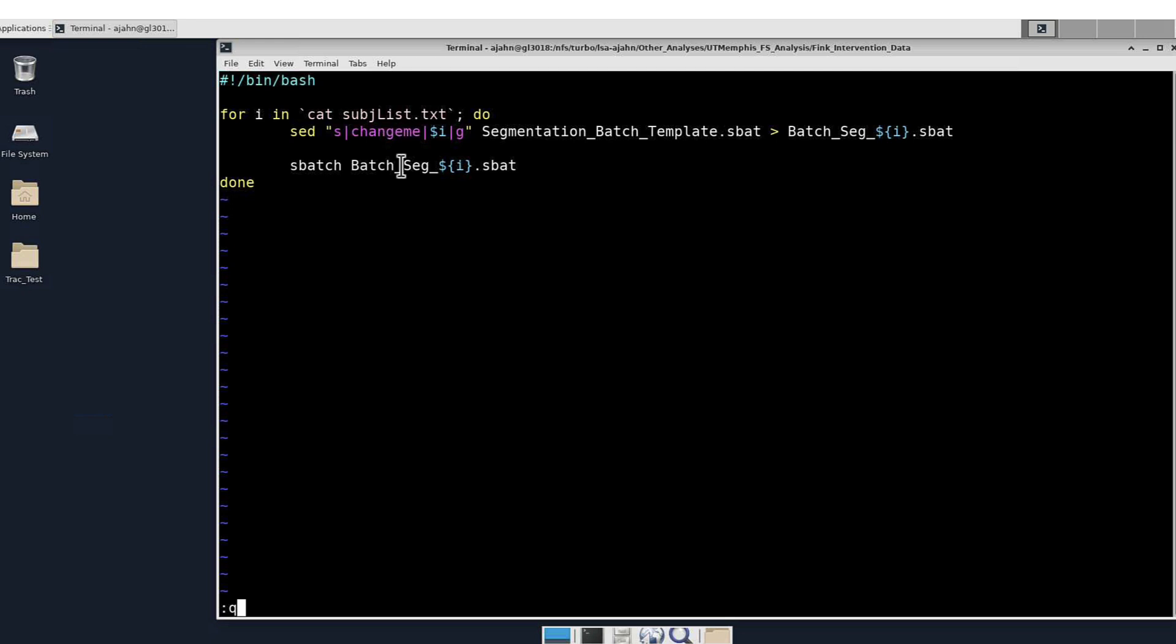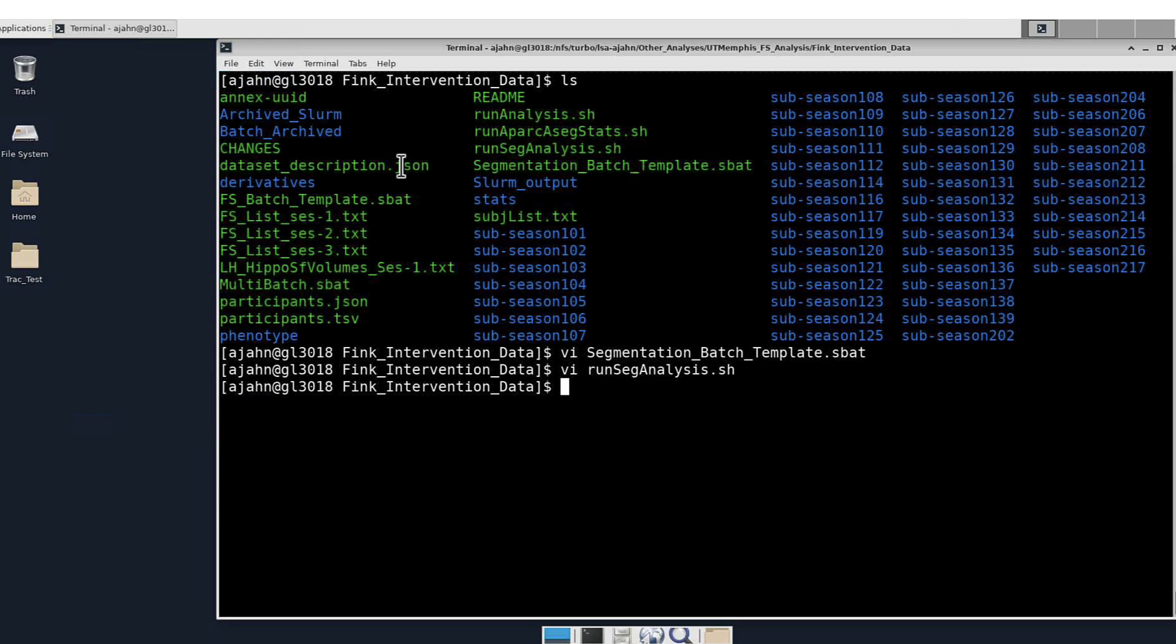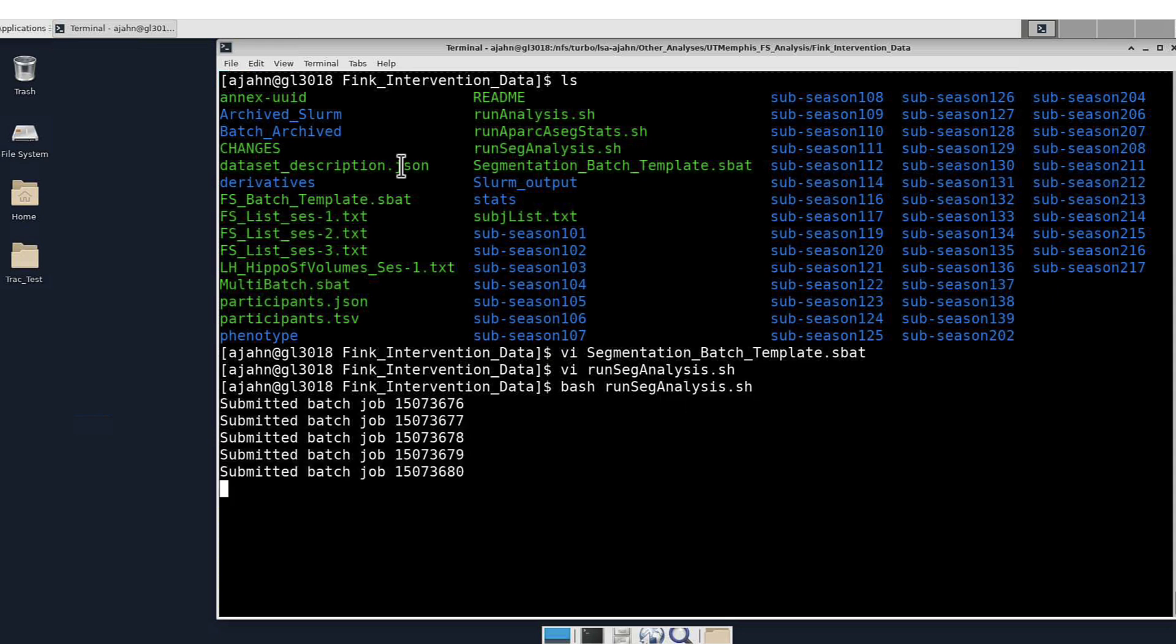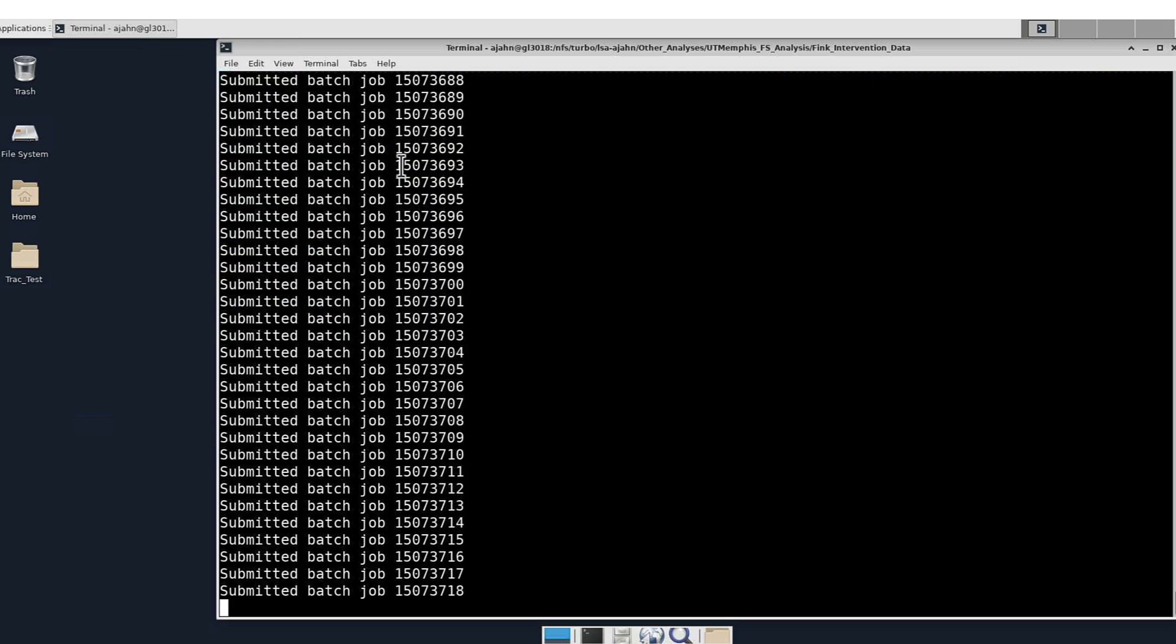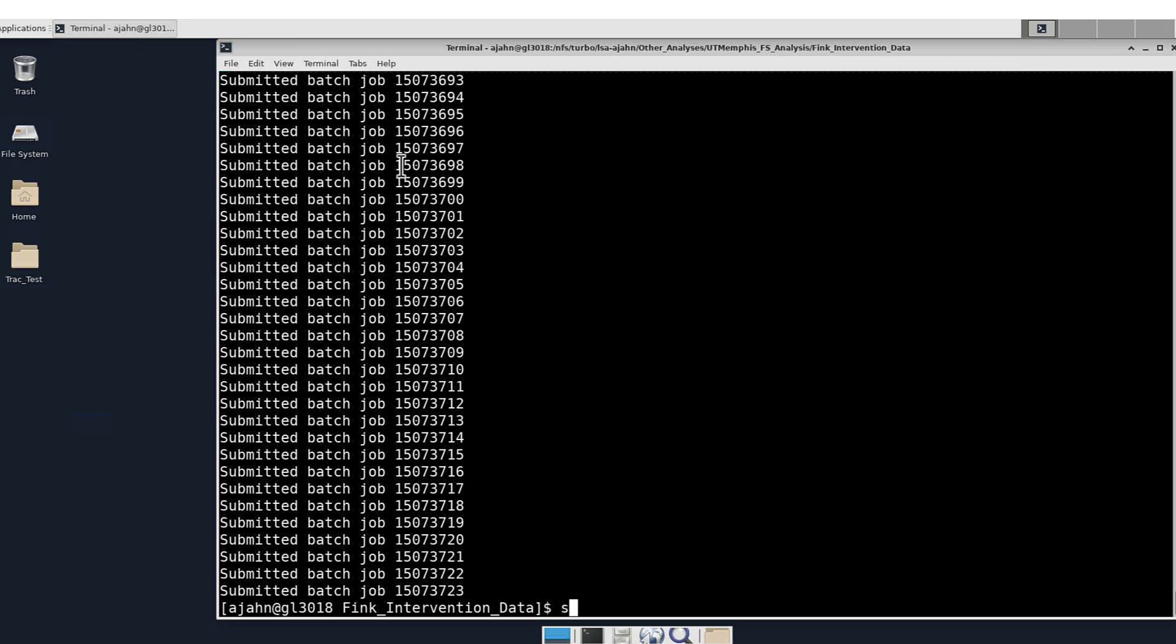I can loop over all of these by submitting this particular script, typing bash runSegAnalysis.sh. You see that all the batch jobs are submitted, which can then be checked with sq.